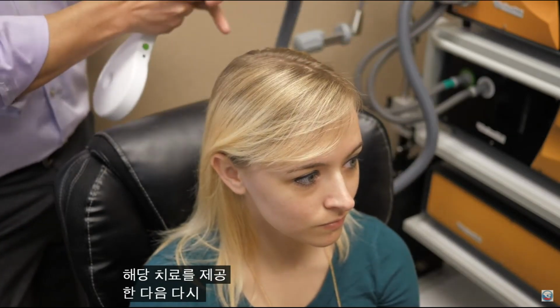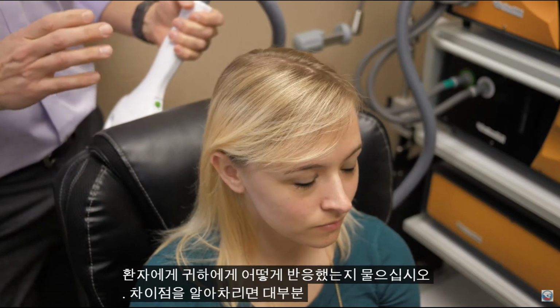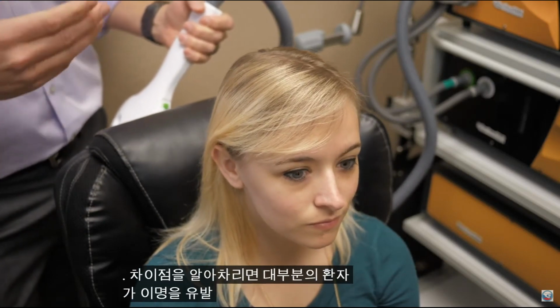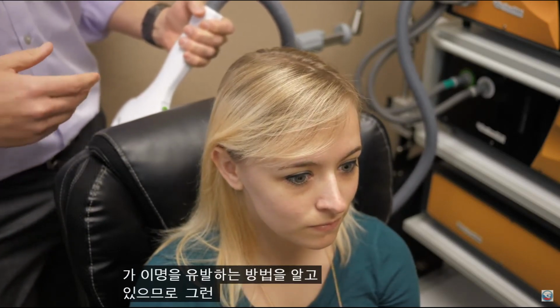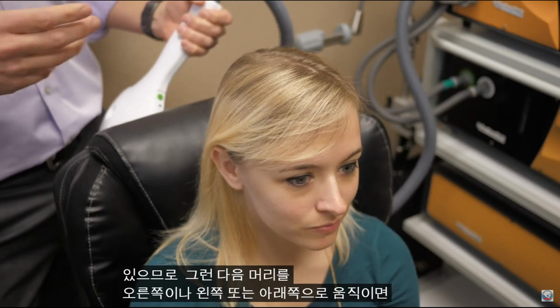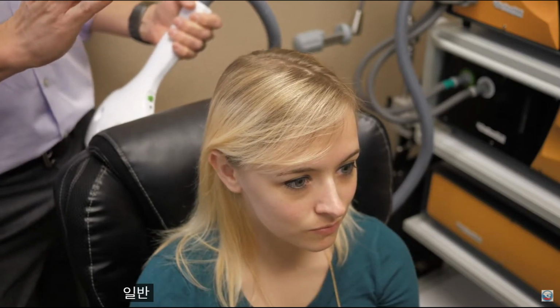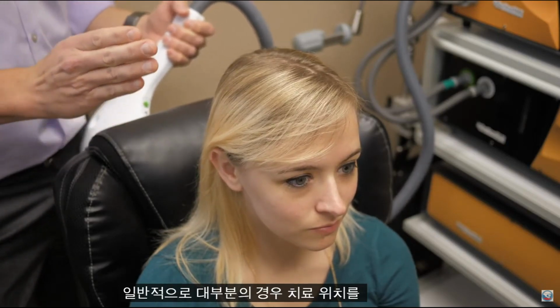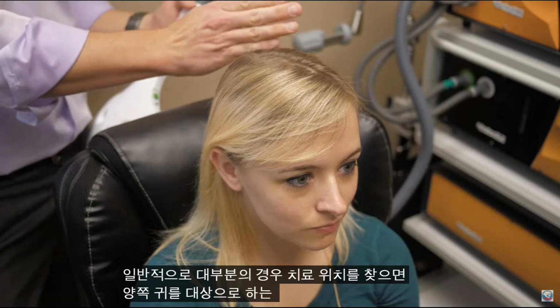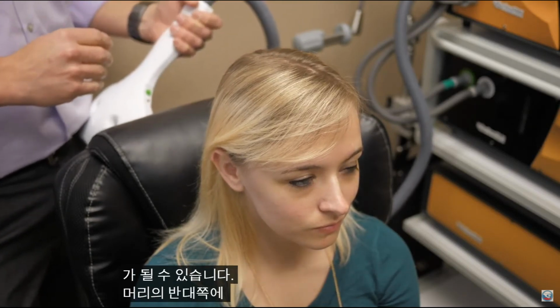And then afterward, you can then again ask the patient, how did you respond? Do you notice a difference? And most patients know how to trigger their tinnitus, and so they will then move their head to the right or the left or downward, and then they can tell the difference. And so then once we find that treatment location, typically in most cases that will be a bilateral treatment to target both ears. In a few instances it might be actually a different location on the other side of the head.